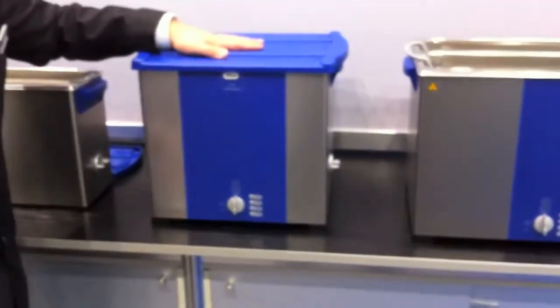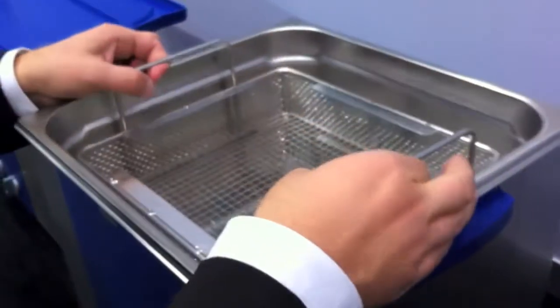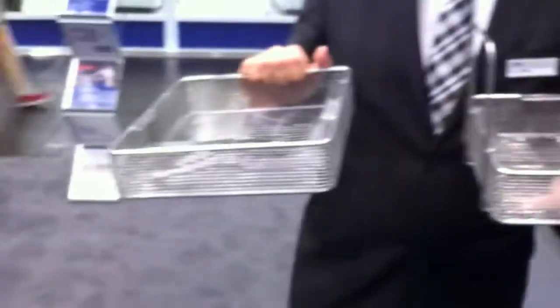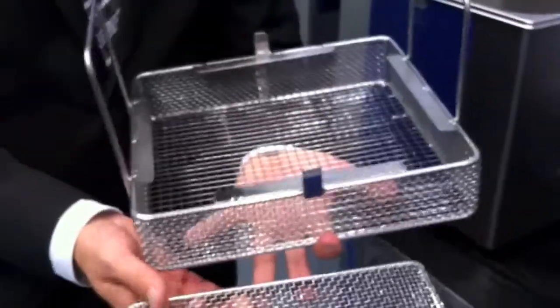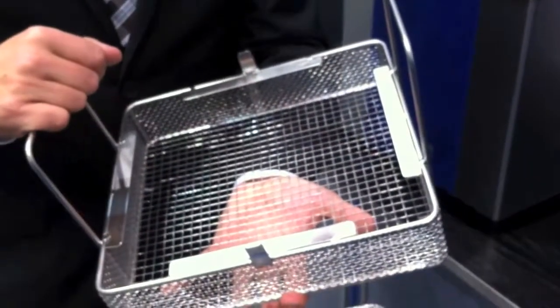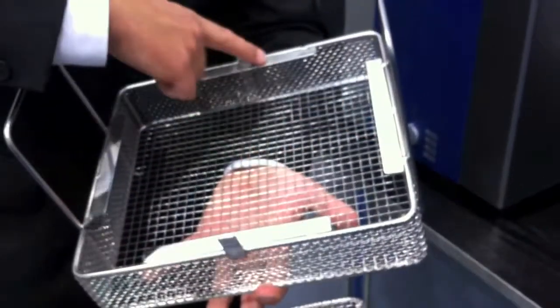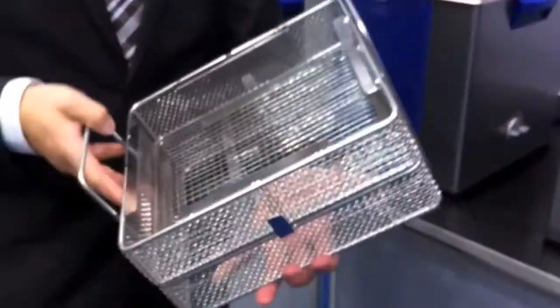Another interesting machine is this one — the Elmasonic S180. The interesting aspect of this machine is that it's perfect to clean flexible endoscope accessory. We have a special two-layer basket so you can clean two layers of instruments on top of each other. Because it's specifically designed for flexible endoscope accessory, you can wire up the accessory and the barriers will prevent it from springing or jumping out of the basket. You can use two layers on top of each other in one machine.